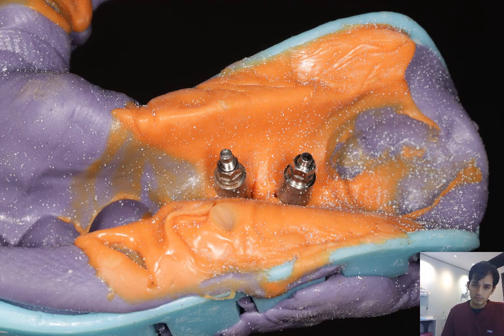Here's a case referring to the flexibility where you can scan multiple implants with a single scan abutment. Now, this is a slide sent to me by a colleague. It's not my case, but you can see the angulation of the implants meant that his impression copings in this case were touching intraorally, and he had to trim them and modify them to get them both to fit together.